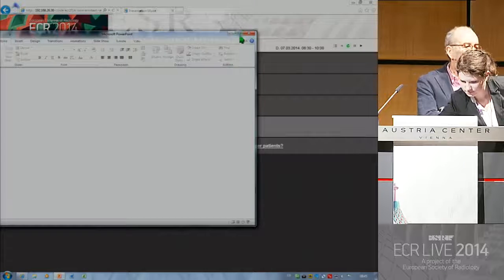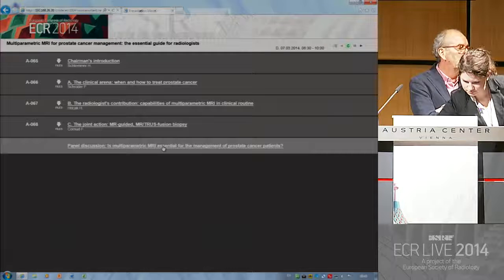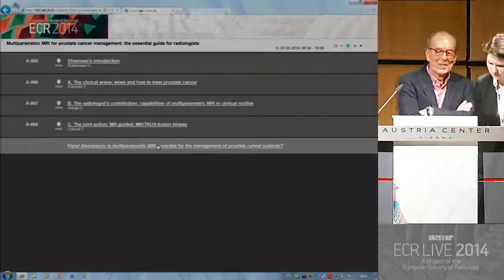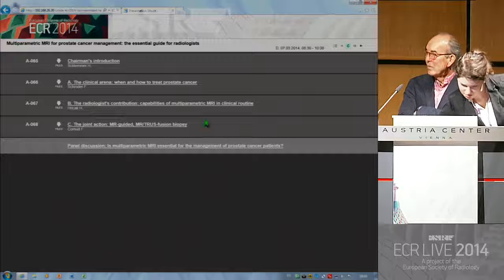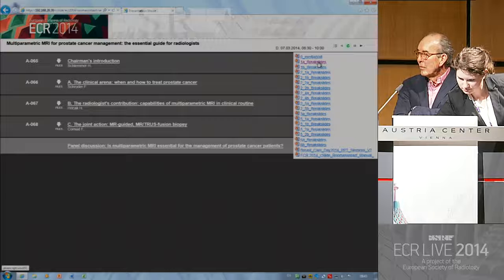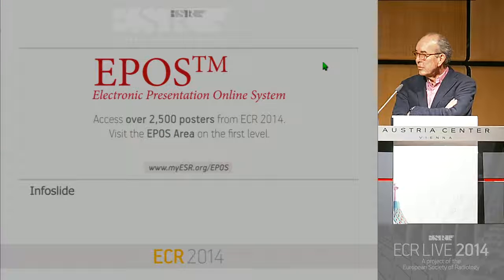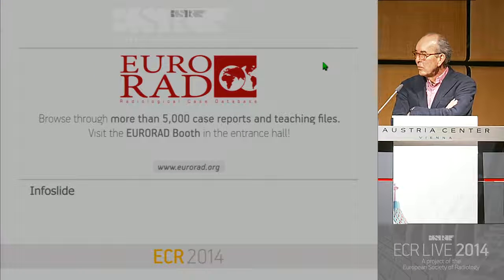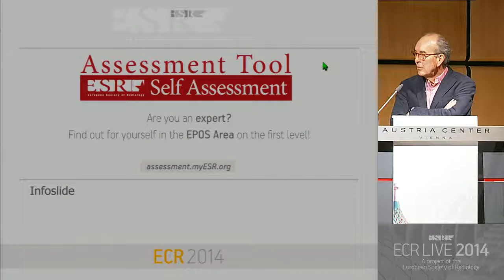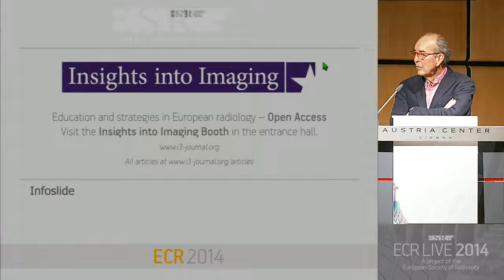Hedi, you mentioned a very important point for all radiologists. You mentioned that it might be that we need only 2 sequences in our protocol. I think this is a very important statement because we have to reduce the examination time. We have to make the examination easier, so that more patients have access to the examination. So do you do at your institution only T2-weighted imaging and diffusion-weighted imaging? And the second question is, what about the B-value of the diffusion-weighted imaging? It might be critical. What is your advice here?